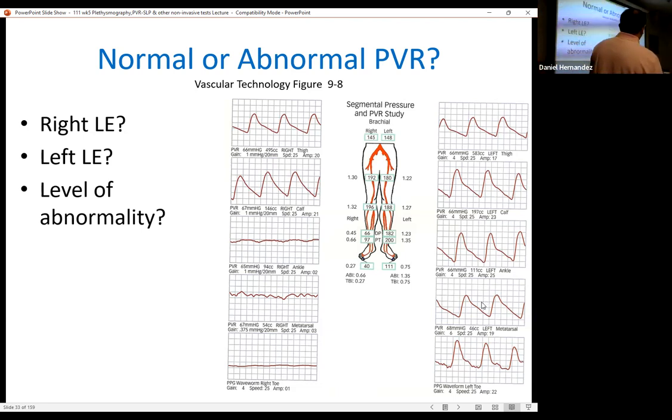I would think that has like a runoff or whatever. Well, this is actually using that PPG sensor, so it's different. It's very sensitive, so you can get a much sharper, crisper tracing.